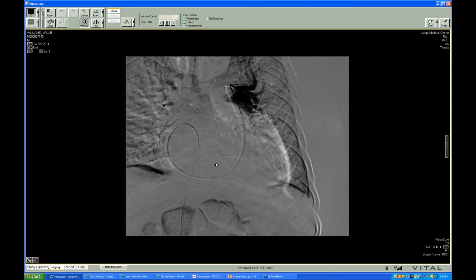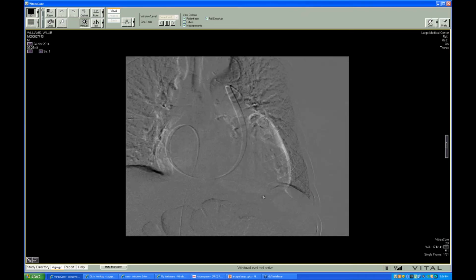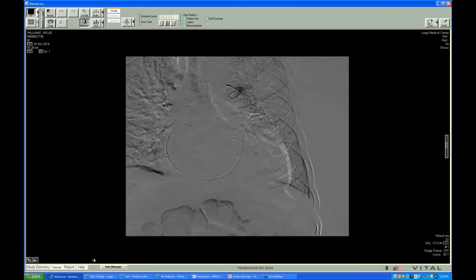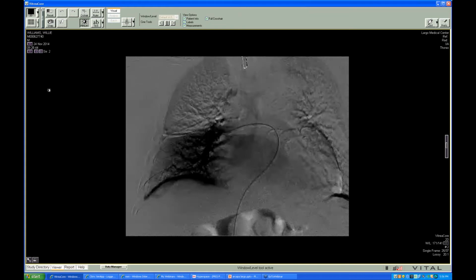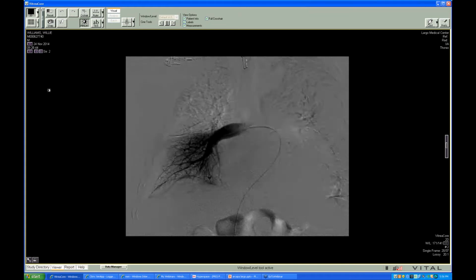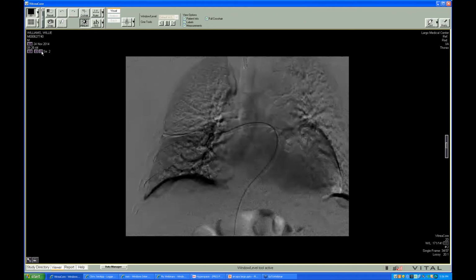Oh, look at that! An injection. Cool. Were you expecting the fistula with prograde flow from the pulmonary? We were hoping to see something more, but this is what we got. Pretty cool. Should I slow it down some? Oh, that's going into the left atrium.